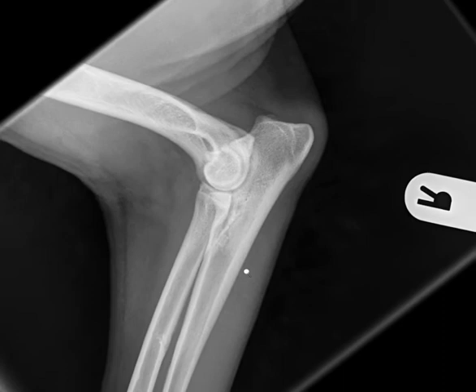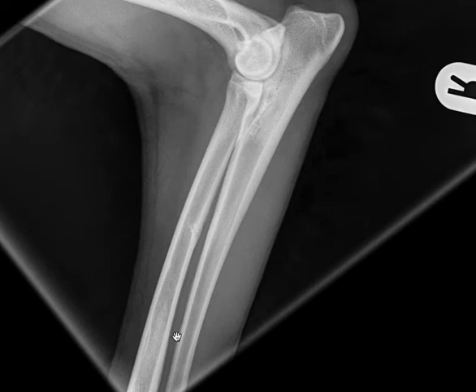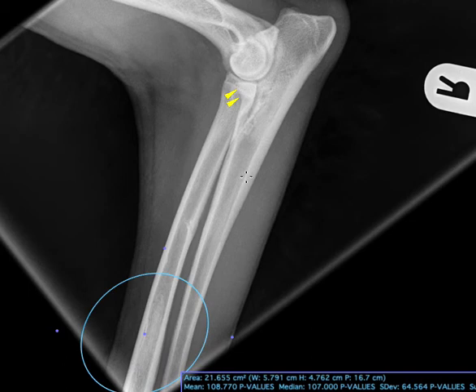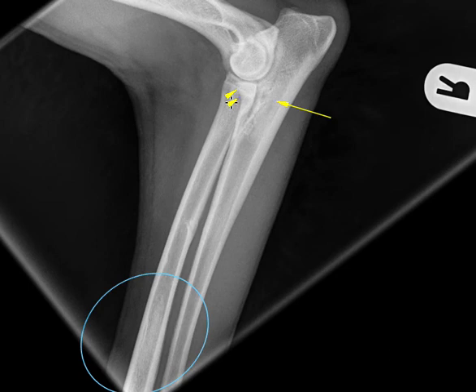Let's go to the right side and have a look there too. I'm going to zoom out a little more to allow us to see not just the ulna but the distal radius in this case. Here's your time to do B for bone and look through the cortex, medullary cavity, periosteal and endosteal surfaces, as well as take a moment to hit the highlights of anatomic areas like the medial coronoid process. What you may notice on this lateral view is that we again have a similar feature in the distal radius. I'm also concerned about increased opacity in this proximal ulna area. These findings are consistent with increased opacity due to a change from medullary fat to medullary soft tissue — from cells, hemorrhage, edema, or inflammation.